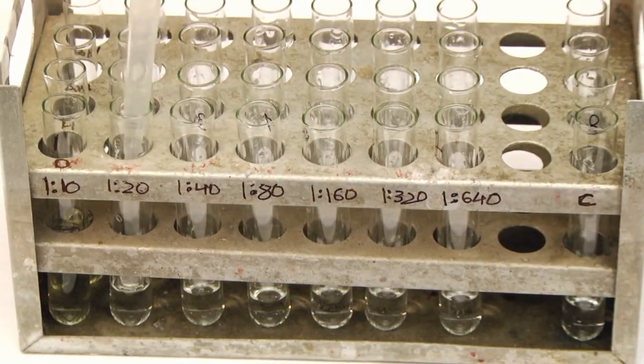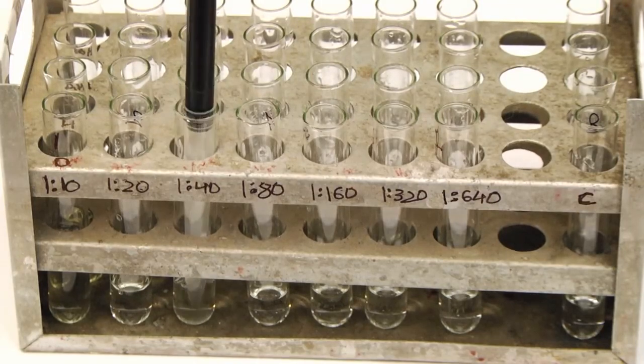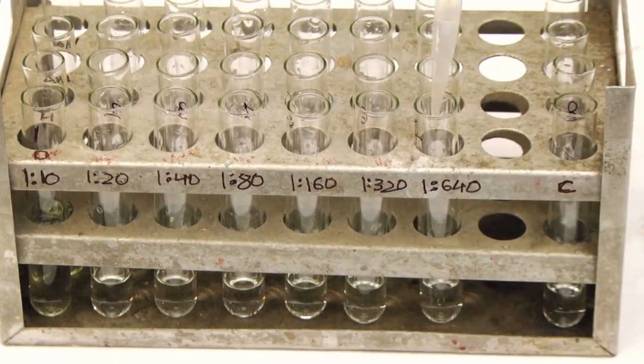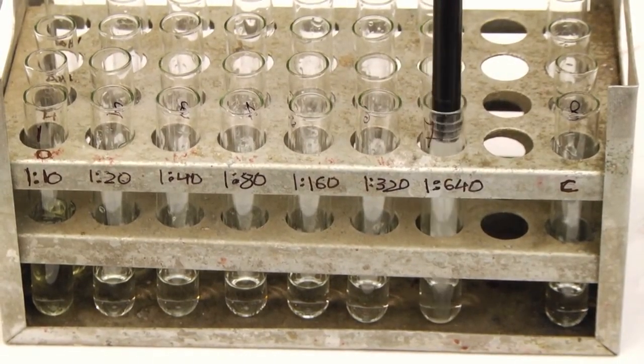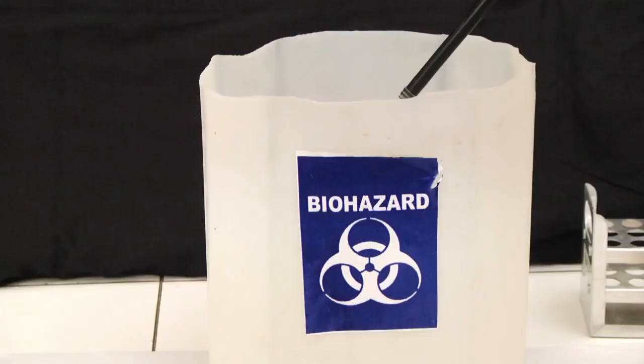Transfer 1 milliliter of the diluted serum sample from tube number 2 to tube number 3 and mix well. Continue the serial dilution till tube number 7 in each set. Discard 1 milliliter of the diluted serum from tube number 7 of each set.